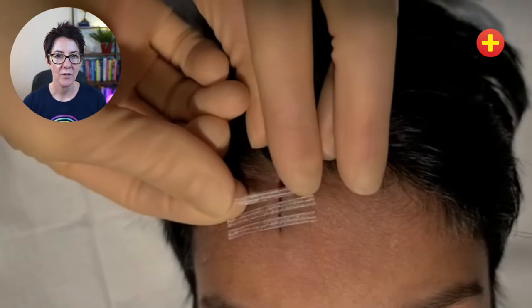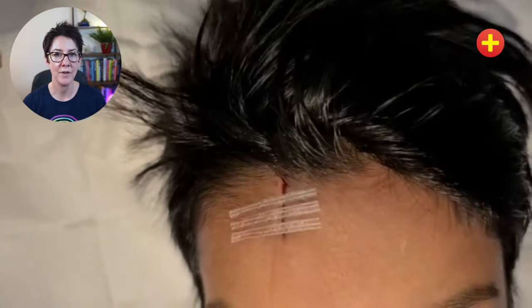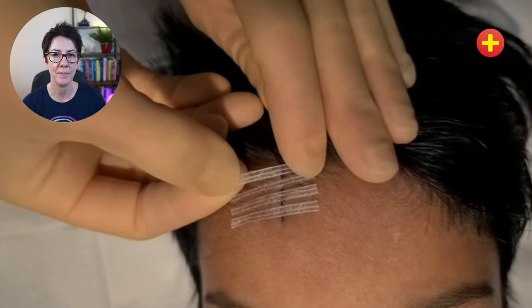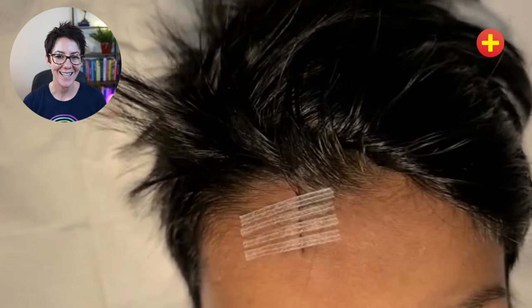The strips themselves are going to be at 90 degrees to the edge of the wound, and that may mean that the strips are not parallel if the wound isn't a straight line. What we want is for each strip to be at 90 degrees to the edge of the wound — that's the way to get the tension right. At the end, get the patient to move that part of their body so that you can check that the wound stays closed under tension, and you can see this child was moving his eyebrows to check that for me.